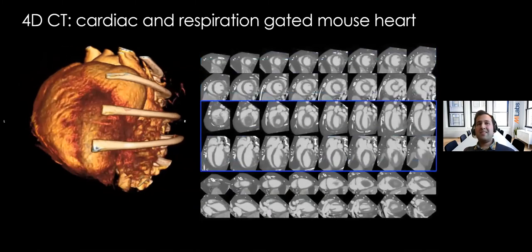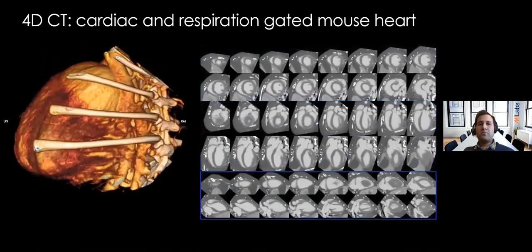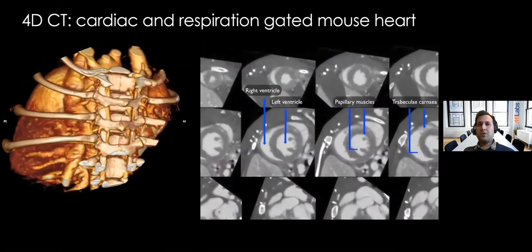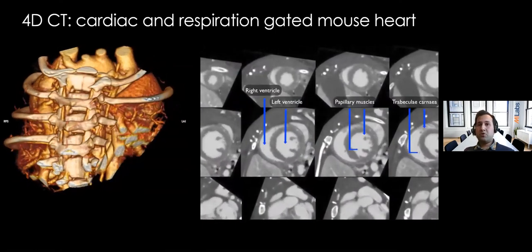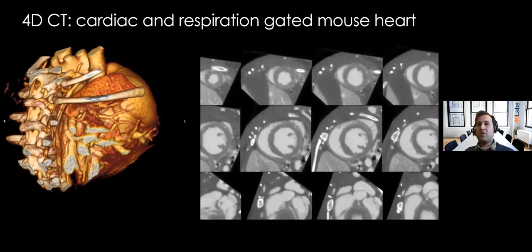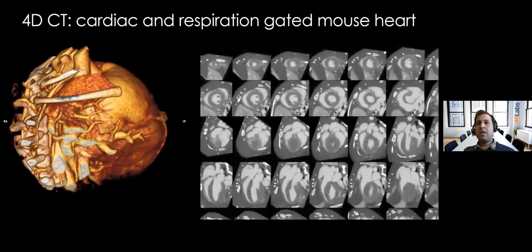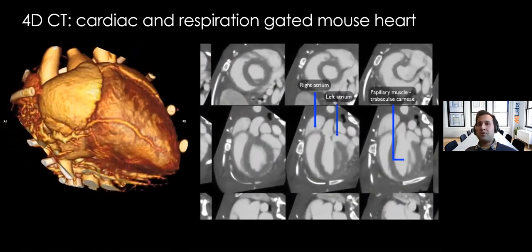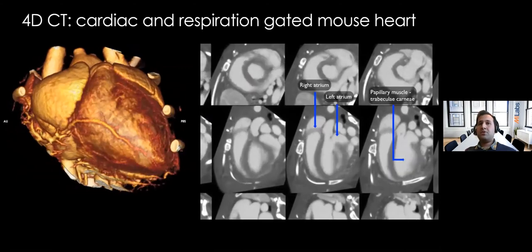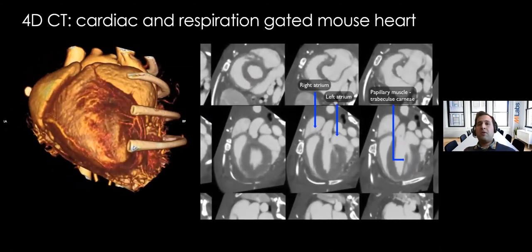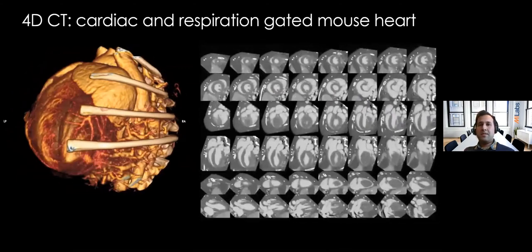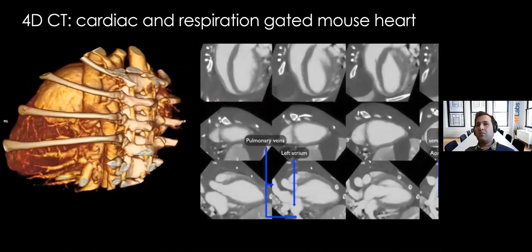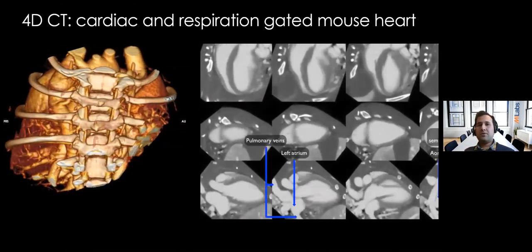Using the microCT, we can capture the fast motion of the heartbeat of a mouse, seeing structures very well like the left and right ventricle, the papillary muscle, and the left and right atrium. We can even look at the pulmonary veins and arteries. This becomes a very important tool for cardiovascular imaging. It is worth mentioning that this image was acquired with the 4D mode of CT, which is a gated image.